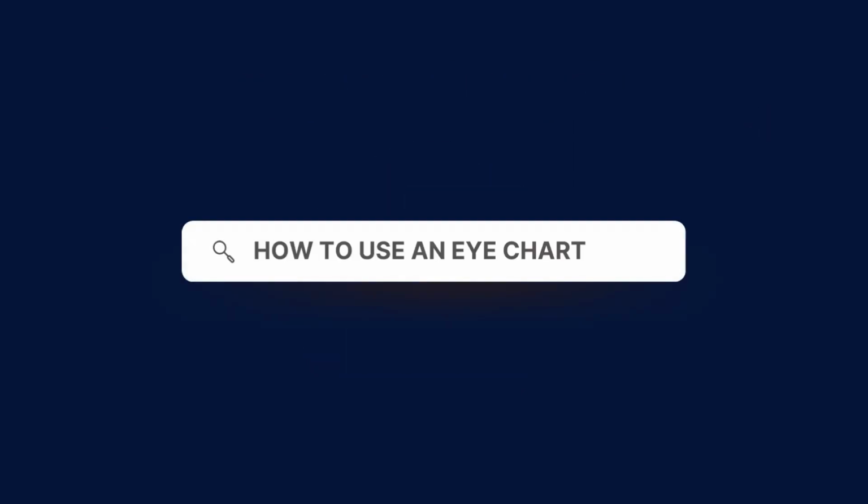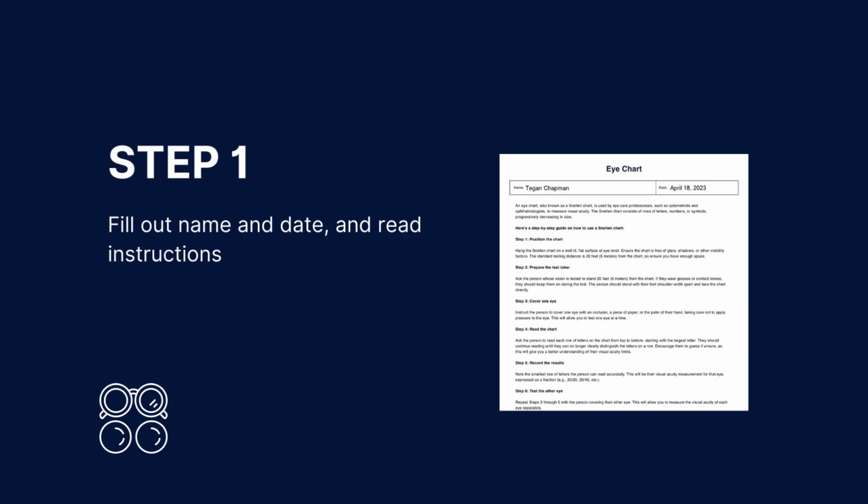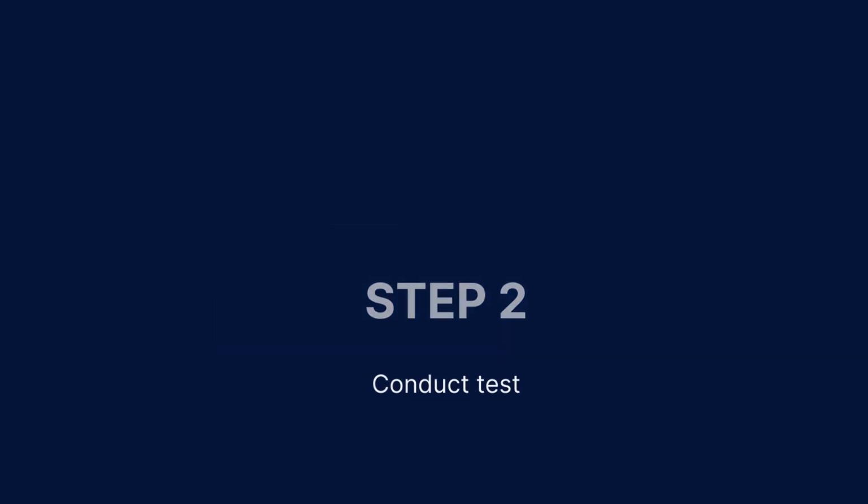Here's how to use an eye chart effectively. The first step is to fill out the name and date at the top and read all the relevant instructions. You'll then need to conduct the test.